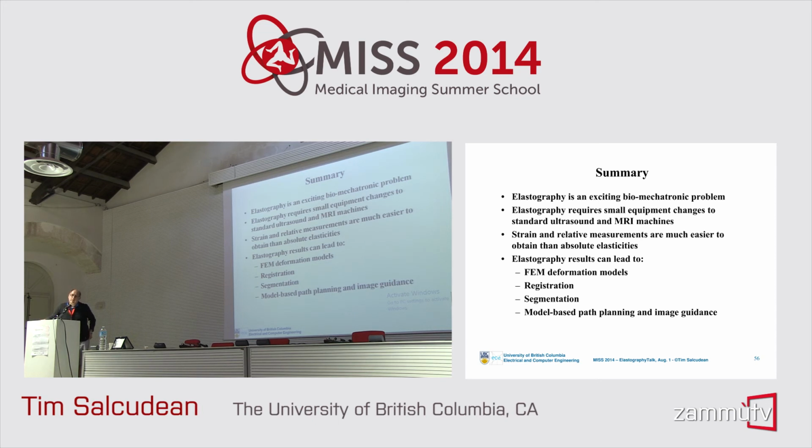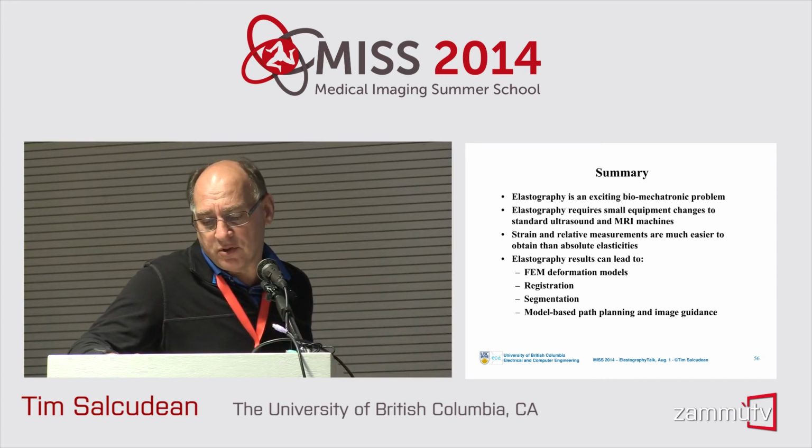Okay. So to conclude, I think elastography is a really exciting biomechatronic problem. It involves everything: actuator design, pulse sequence design for MR, RF data measurement for ultrasound, beamforming, and all sorts of neat things. But in general, it requires small equipment changes, and it can be implemented on a standard ultrasound and MR machine.